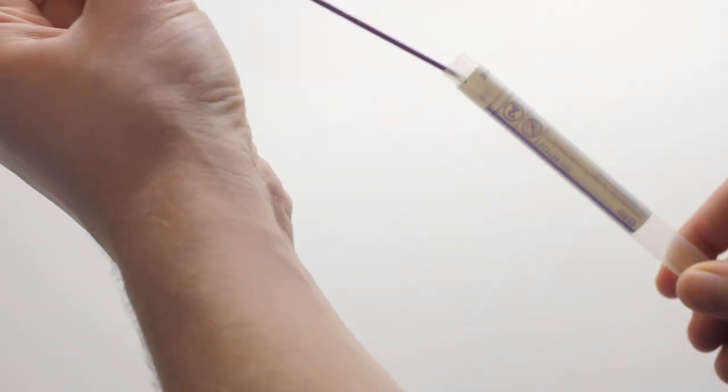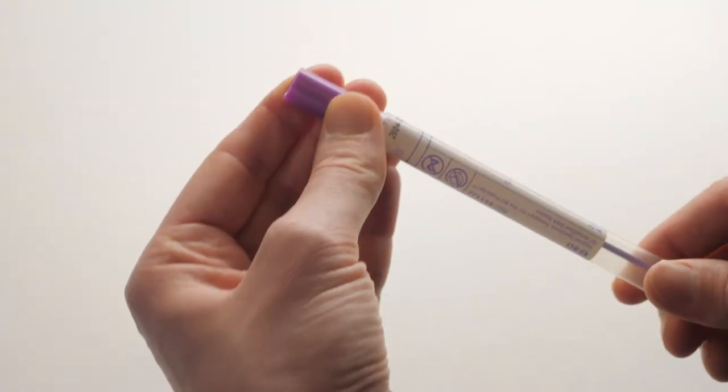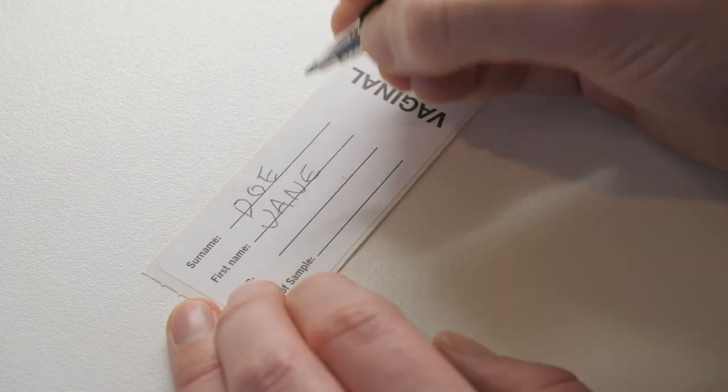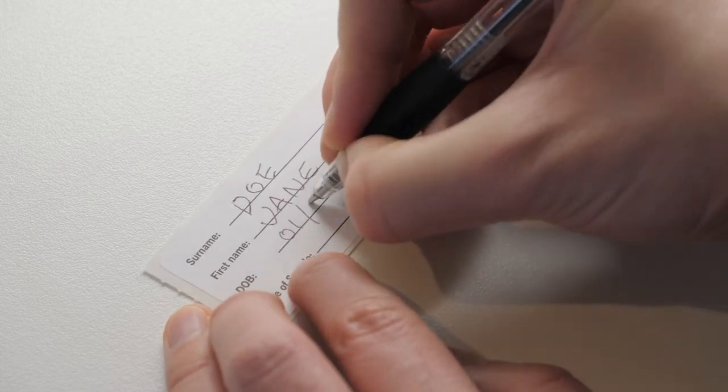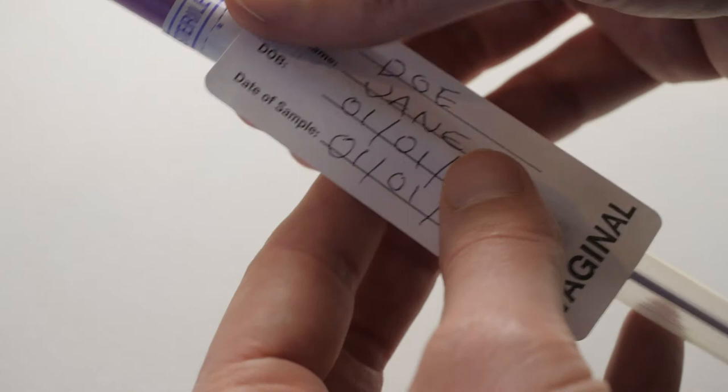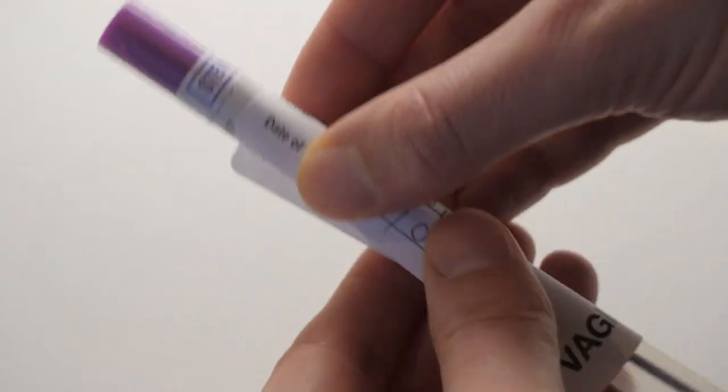Next, return the swab to the tube and tightly secure the cap. Write your full name and date of birth on the label named vaginal supplied in your pack. Affix the label by placing the tube in the middle of the label and wrapping the label around the tube.